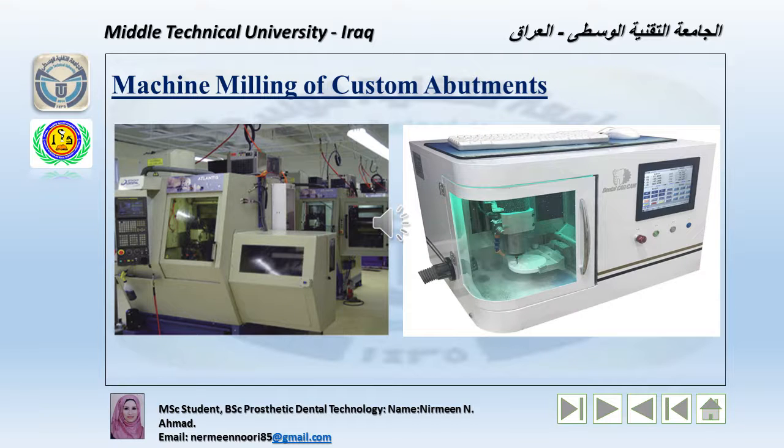After we know the virtual abutment design, we should explain the machine milling of the custom abutment. Although the custom abutment began as the traditional cast gold abutment, today the most frequent materials to be used are titanium, zirconium oxide, and plastic.